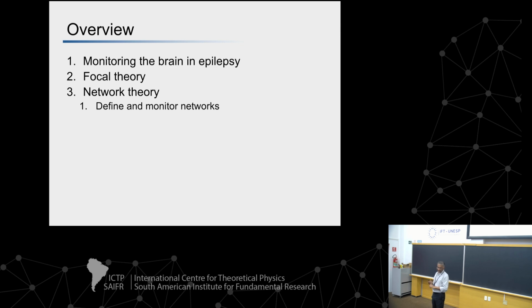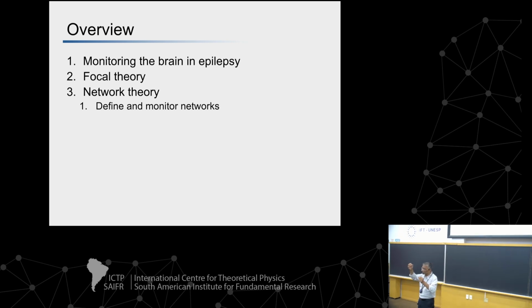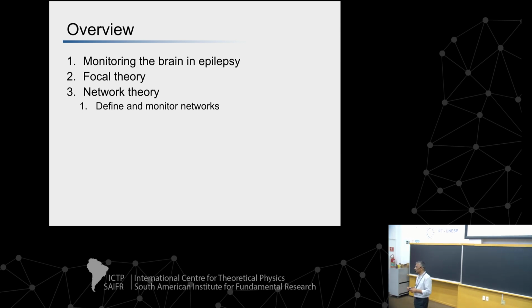The second question is about monitoring not just the neocortex, but subcortical structures. The way we do it is using depth electrodes, which are cylindrical constructions, inserted to target a structure. For the hippocampus, they typically go in orthogonally. From here, you could put two or three electrodes that capture activity in a few parts of the hippocampus, like the head, the tail, the pes, etc. There used to be another method where you went in from the posterior along the whole long axis of the hippocampus, with possibly a contact in the amygdala as well. But that's the best way we have of targeting subcortical structures.